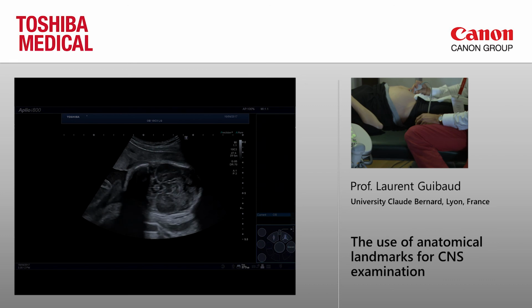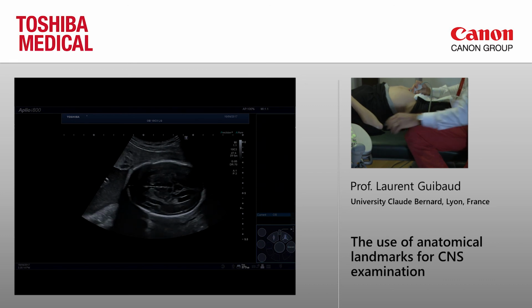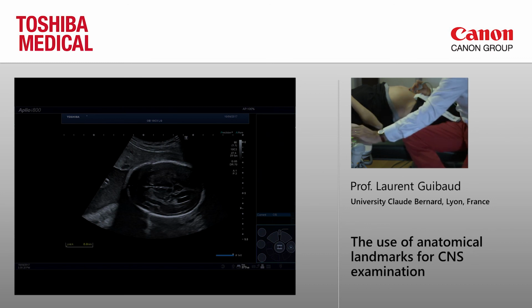So you see the ventricle. It can be interesting to see also this. What is this? You see one line and one line. It is the third ventricle. And between the third ventricle and the fourth ventricle, there is the aqueduct.